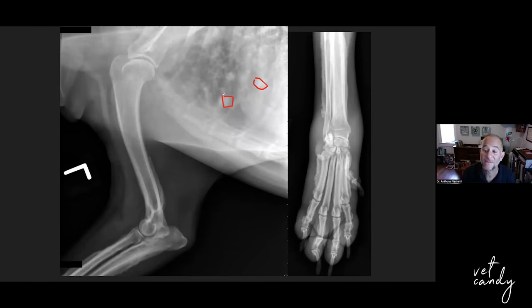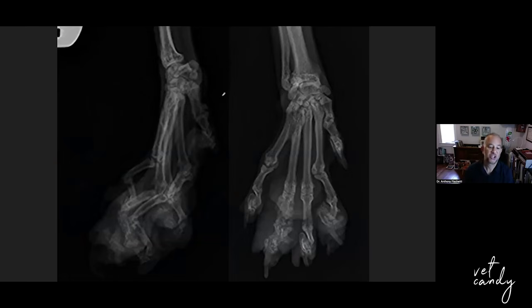If you get rid of the mass, it actually does a really good job of alleviating the clinical signs. The periosteal reaction improves or goes away completely. So yeah, if you treat the primary problem in the thorax or in the abdomen, you can address this stuff. So it's not metastasis to the periosteum, okay? It's a neurohormonal or a neurovascular response as a paraneoplastic syndrome, okay? That's really important to differentiate from something that we see in cats.